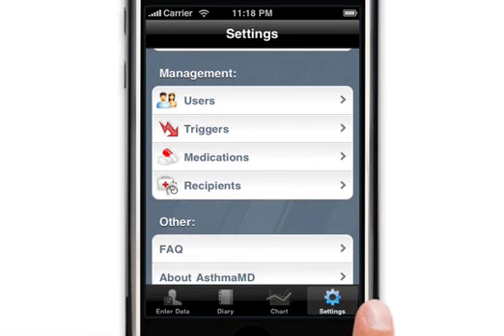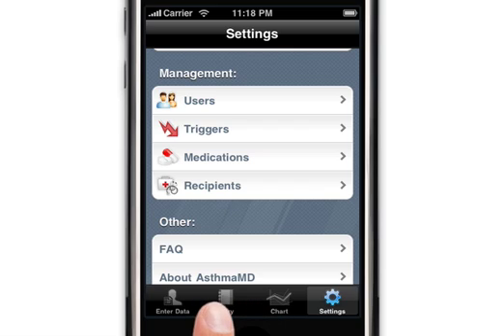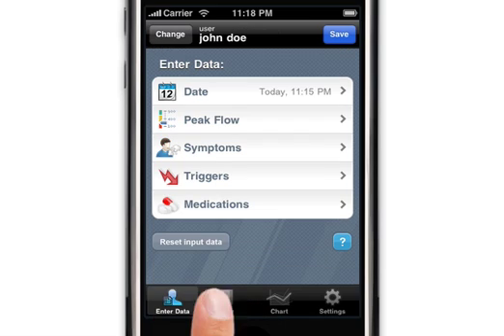Back to the settings, at the bottom of the settings page there are frequently asked questions and answers and information about asthma that you can use.